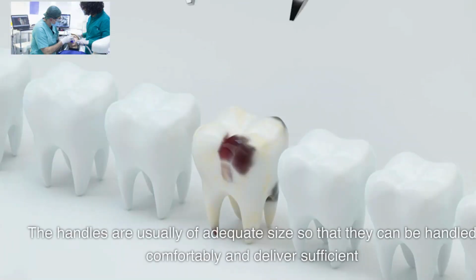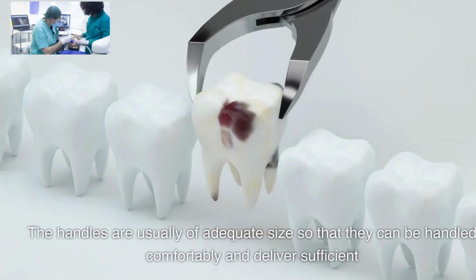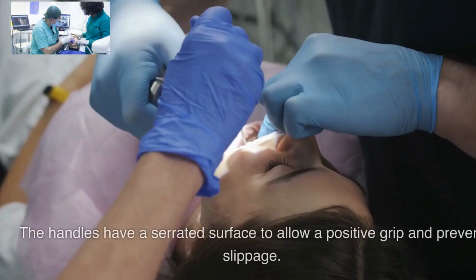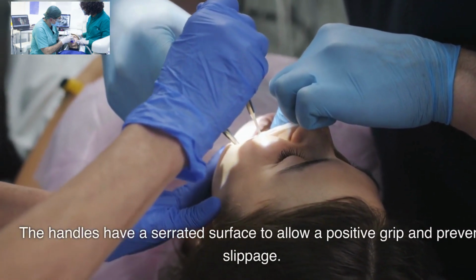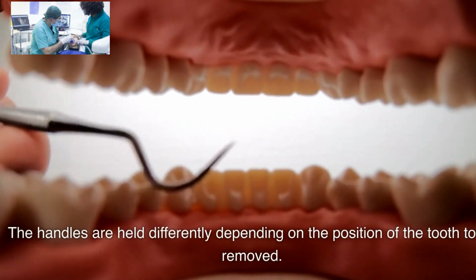The handles are usually of adequate size so that they can be handled comfortably and deliver sufficient pressure and leverage to remove the required tooth. The handles have a serrated surface to allow a positive grip and prevent slippage. The handles are held differently depending on the position of the tooth to be removed.